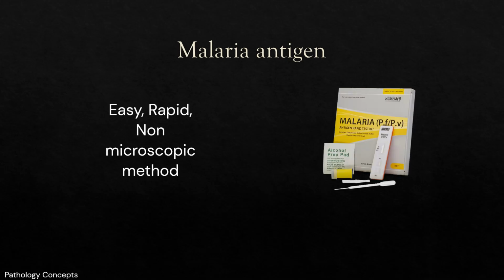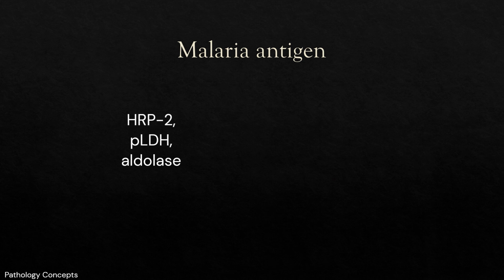Malaria antigen. The immunochromatographic dipsticks are easy, rapid, non-microscopic methods for malaria diagnosis, and they save training and time. Malaria antigens currently targeted by rapid detection kits are HRP2, pLDH, and Plasmodium aldolase.